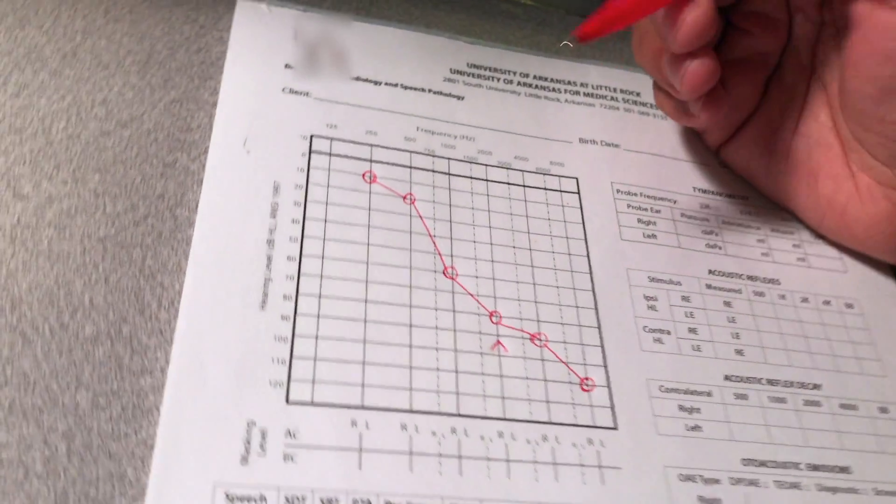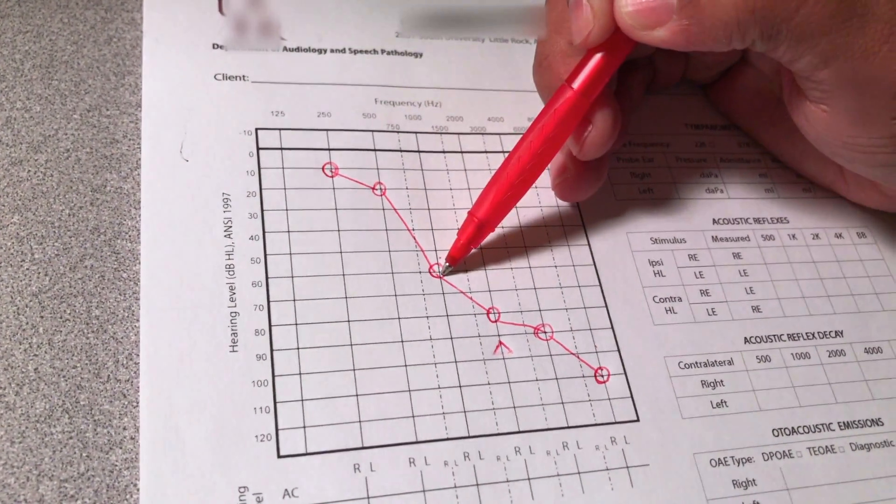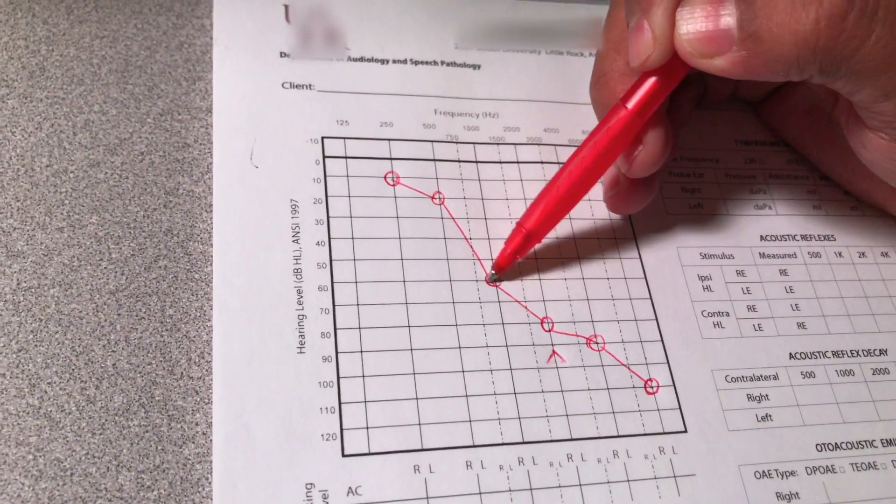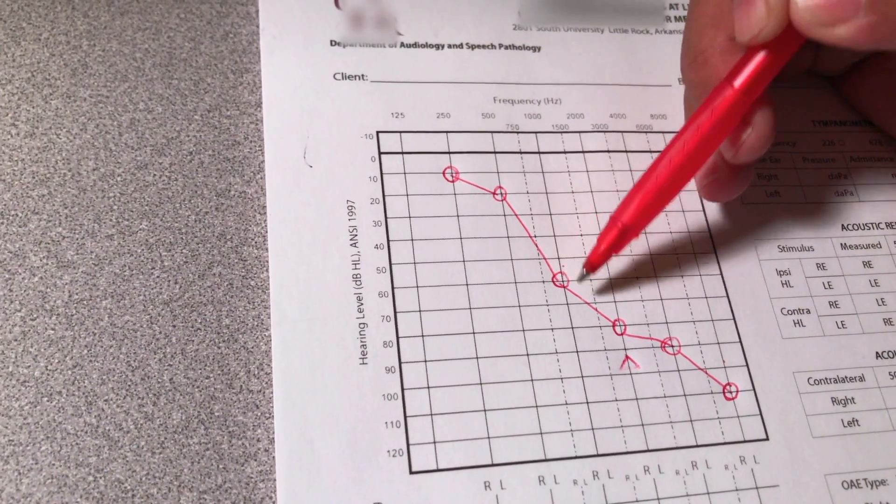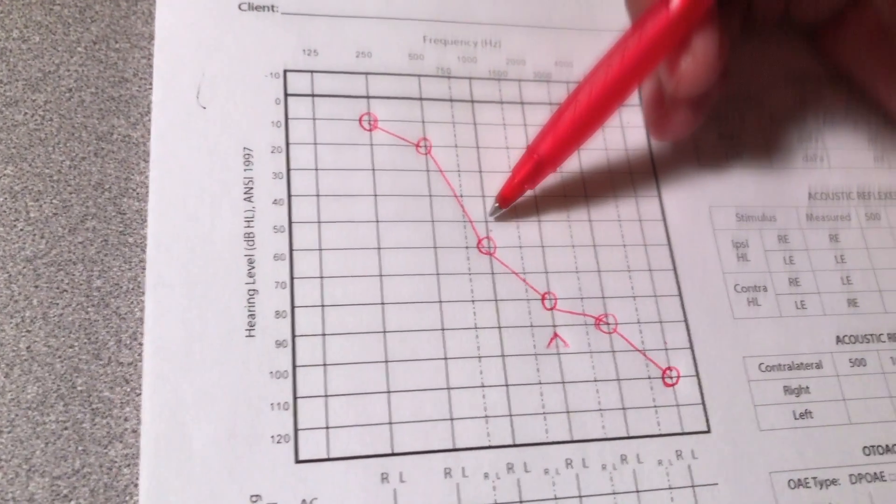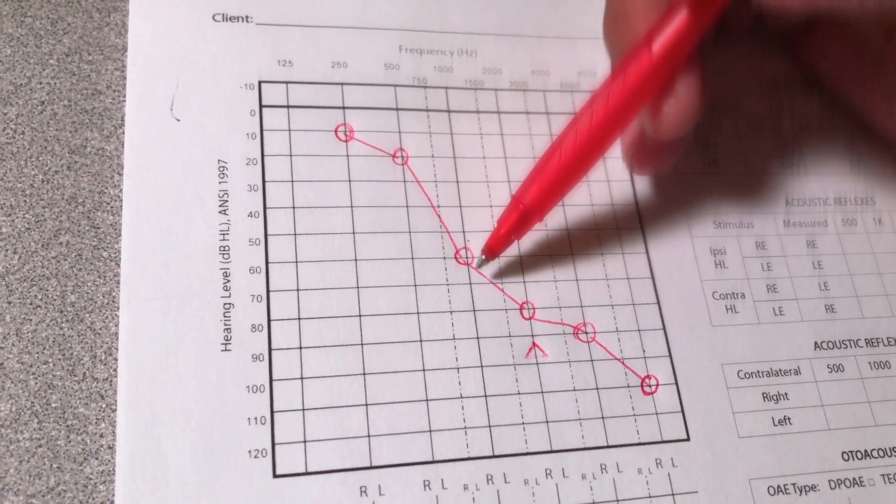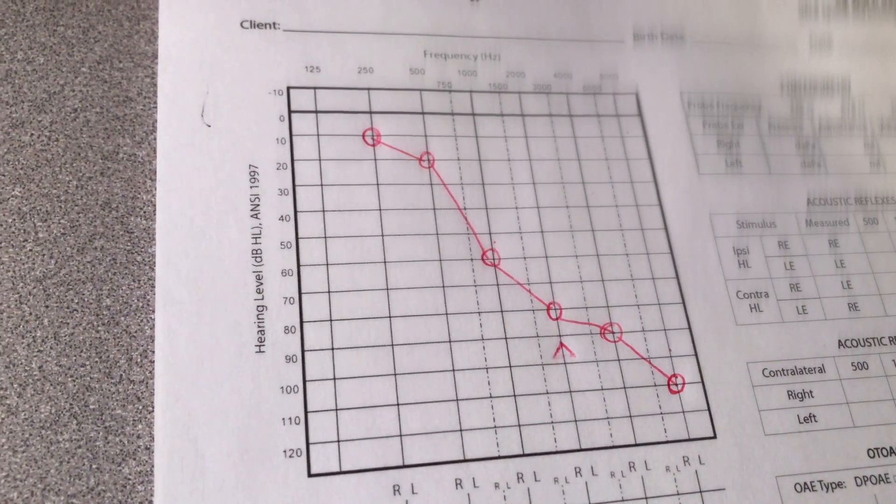Now if you want to measure the threshold at 1000 Hertz, where the person's actual threshold is 60 dB, you need to set the noise level at 70 dB. If the threshold is below 60 dB, anywhere even if it was at 50 dB, set the noise threshold at 70 dB.